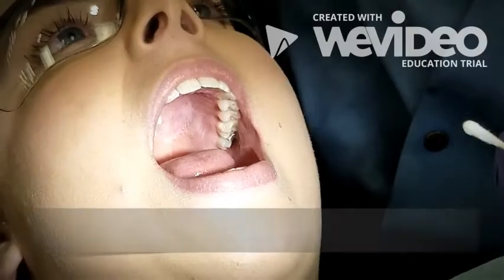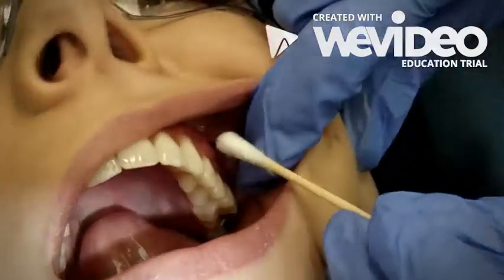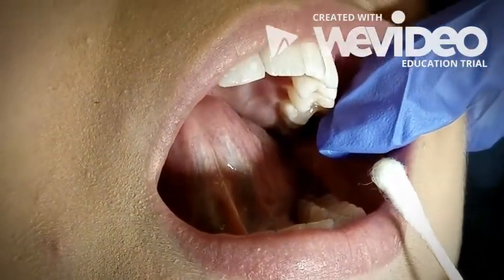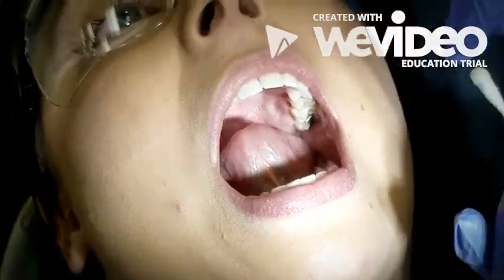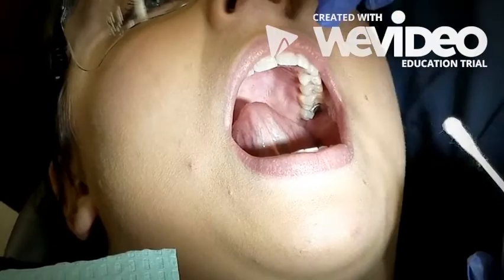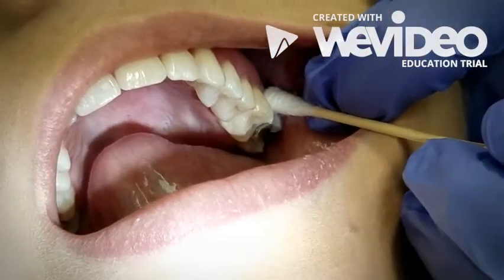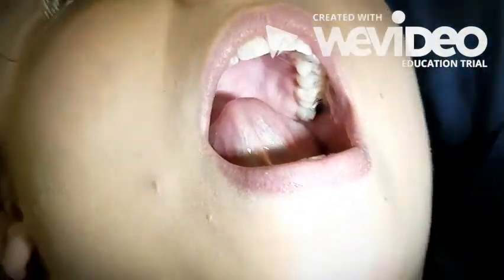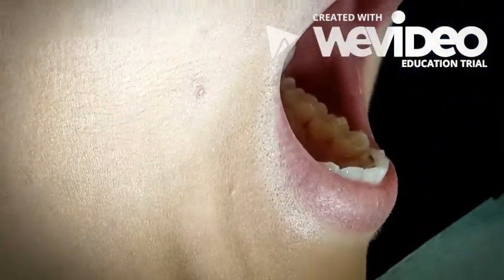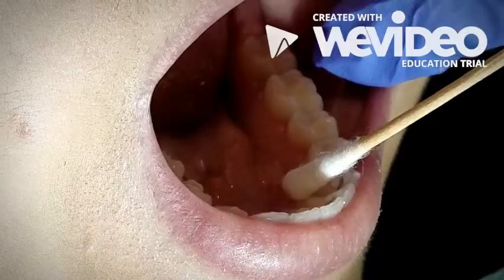The PDL, or periodontal ligament injection, anesthetizes a single tooth and the corresponding tissue, facially and lingually. The wand makes it possible to administer a PDL without the discomfort often associated with this injection. When giving a PDL on the maxilla, we inject on the facial, mesiofacial or distal-facial line angles for molars, and direct facial for premolars and anteriors. When giving a PDL on the mandible, we inject on the lingual, mesiolingual or distal-lingual line angles for molars, and direct lingual for premolars and anteriors.